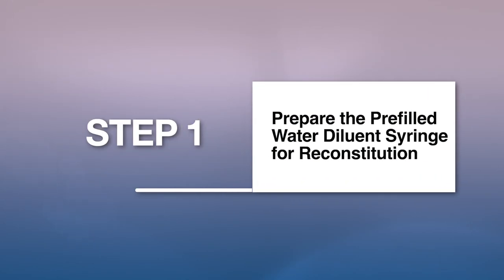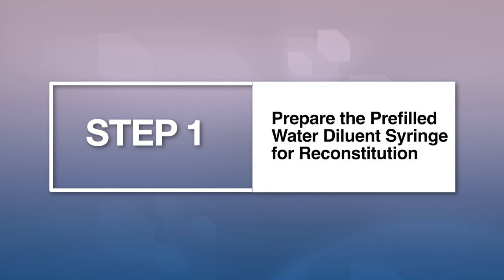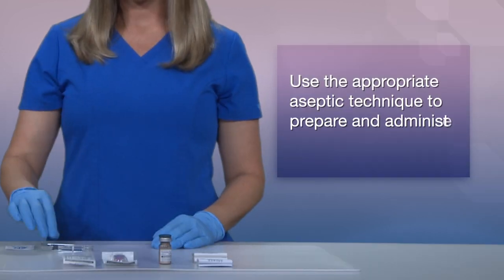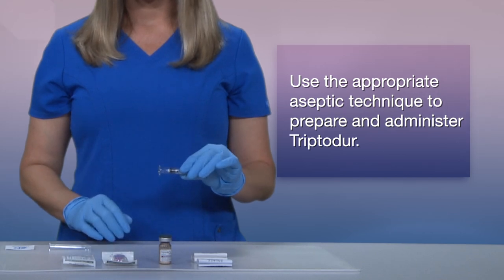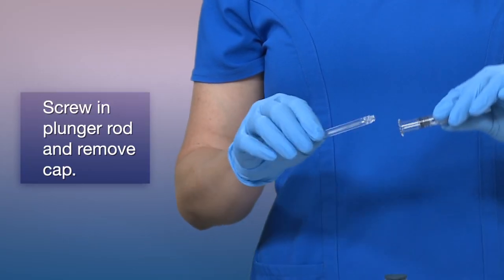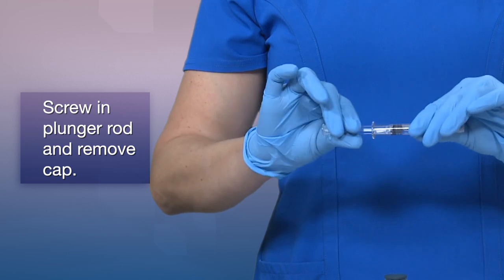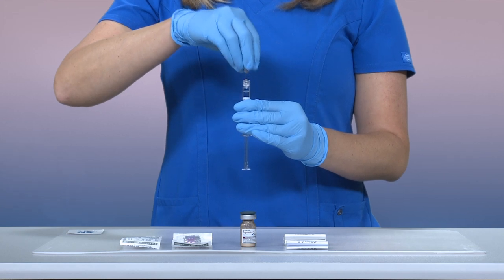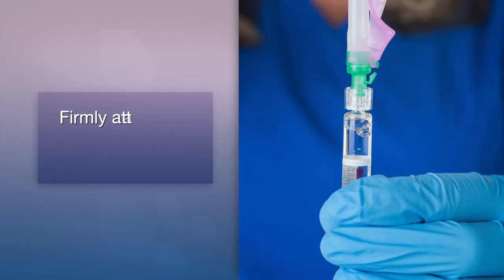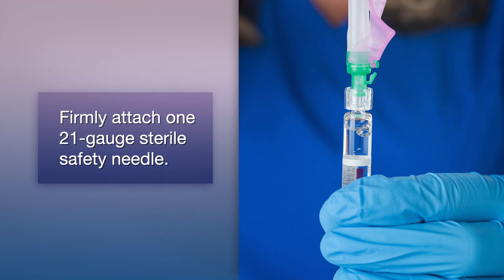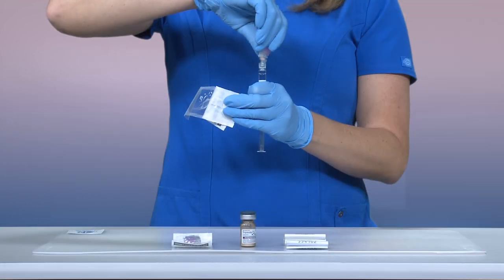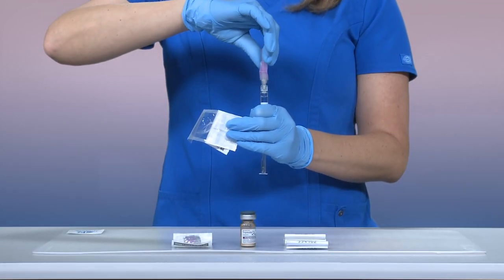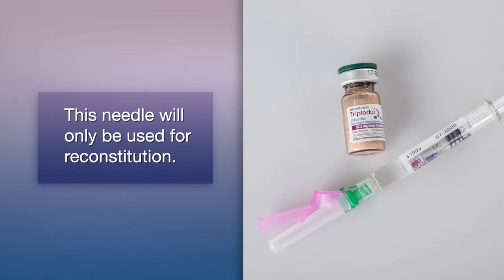Step 1: Prepare the pre-filled water diluent syringe for reconstitution. Use the appropriate aseptic technique to prepare and administer Tryptidor. Screw the plunger rod into the barrel end of the pre-filled sterile water diluent syringe. To remove the cap, twist to separate from the luer lock on the syringe barrel. Next, firmly attach one of the 21-gauge sterile safety needles onto the pre-filled sterile water diluent syringe with a push and clockwise twist. This 21-gauge needle will only be used for reconstitution of the product.